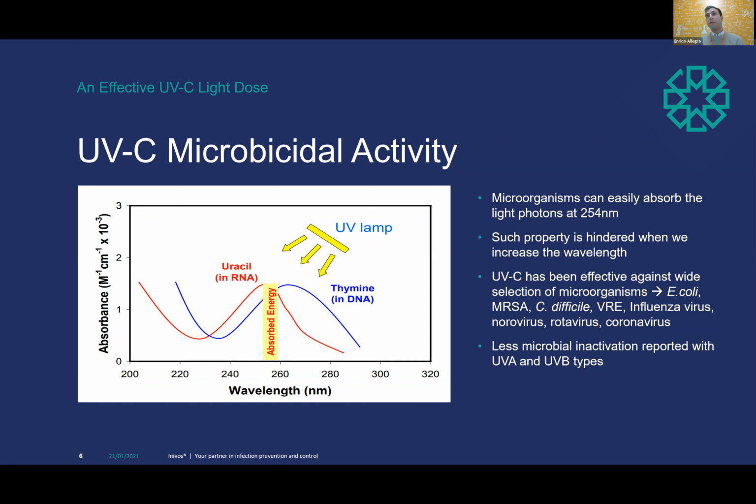It has proven a very wide spectral activity, going against bacteria, viruses, and spores at the same time. Just to briefly mention, UVA and UVB, which are not discussed much in this presentation, have been shown to have much less inactivation, so will achieve less efficacy against bacteria. Hence, that's why UVC is the most used at the moment.